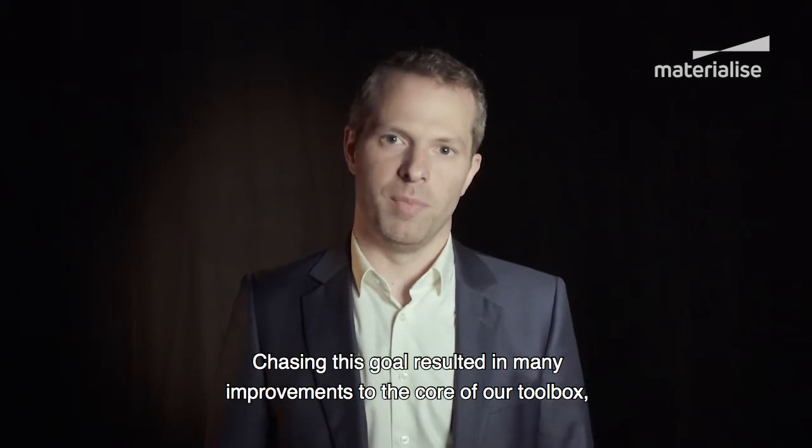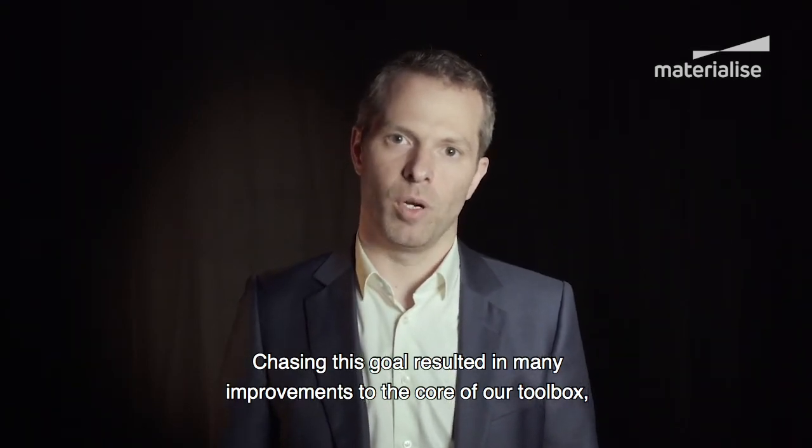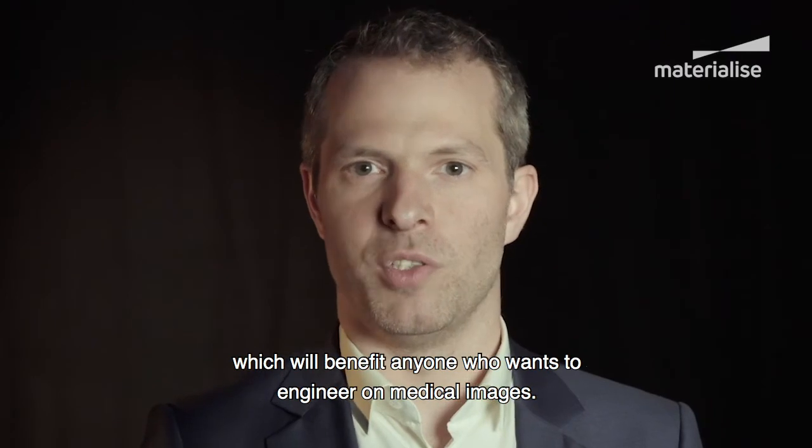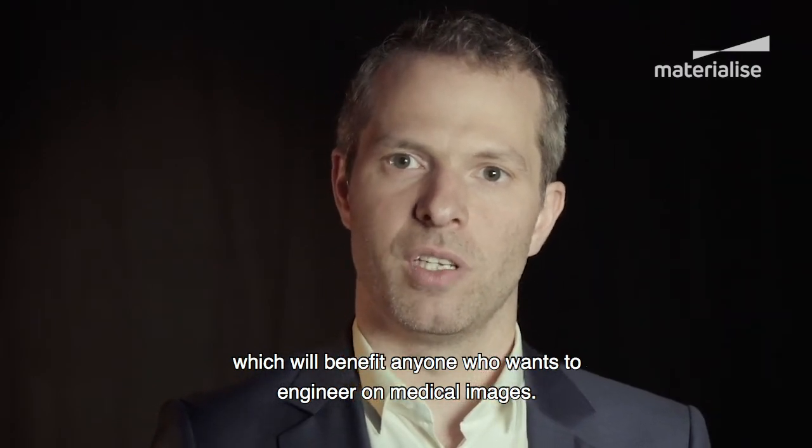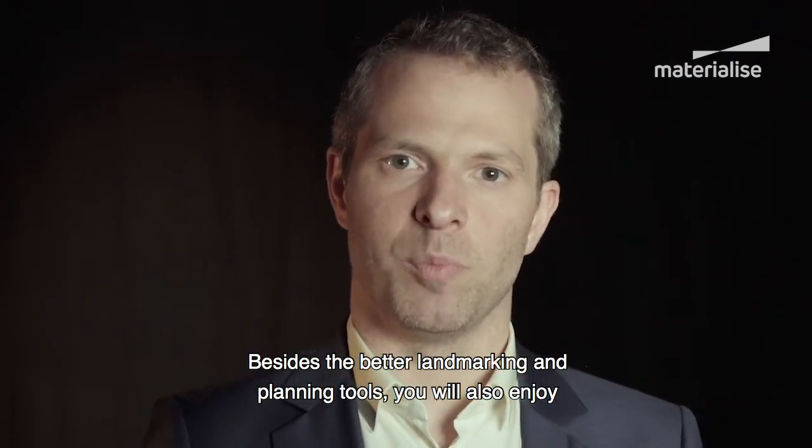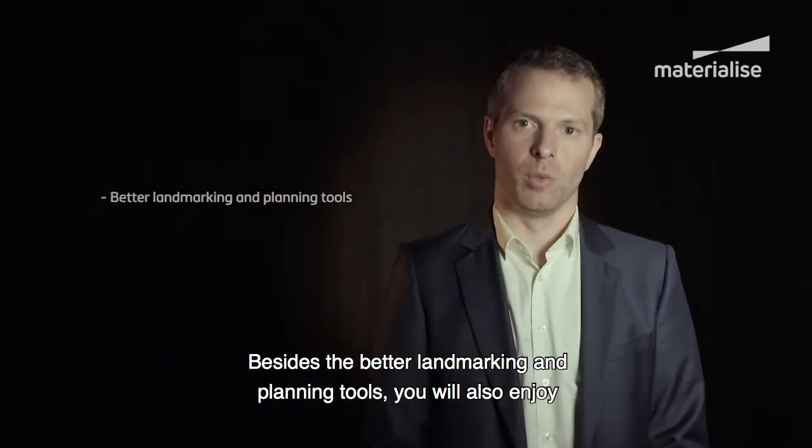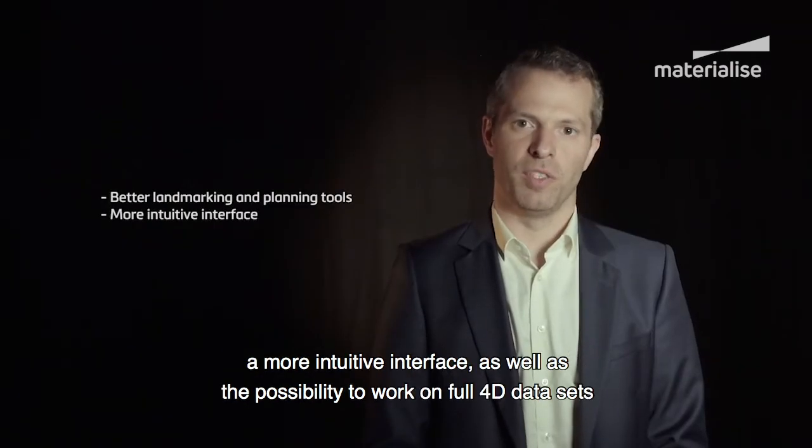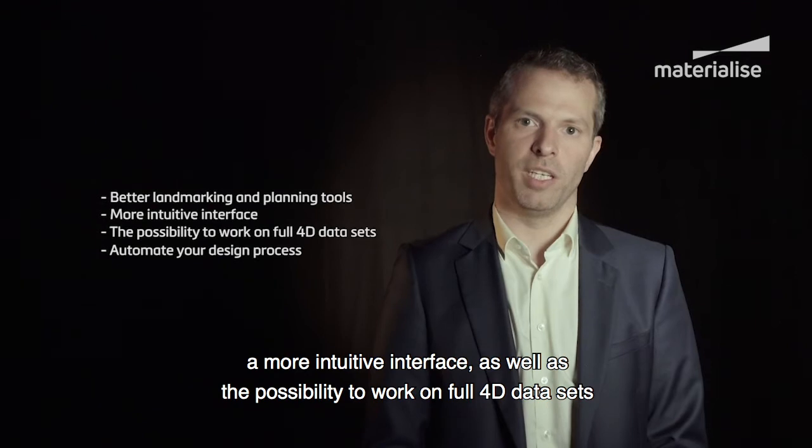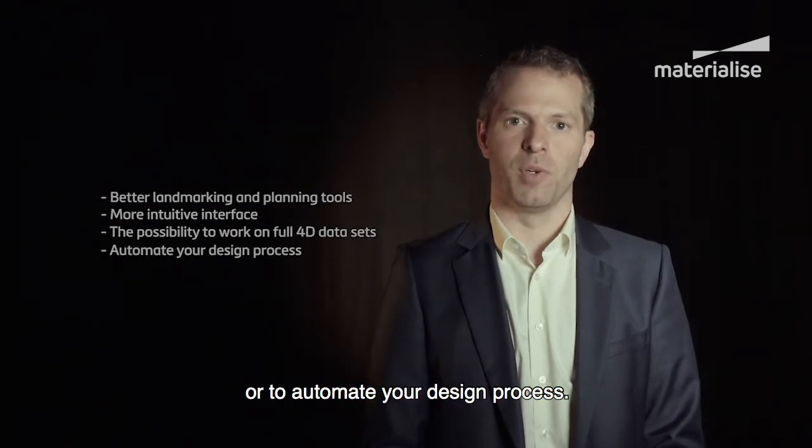Chasing this goal resulted in many improvements to the core of our toolbox which will benefit anyone who wants to engineer on medical images. Besides the better landmarking and planning tools, you will also enjoy a more intuitive interface as well as a possibility to work on 4D datasets or to automate your design process.